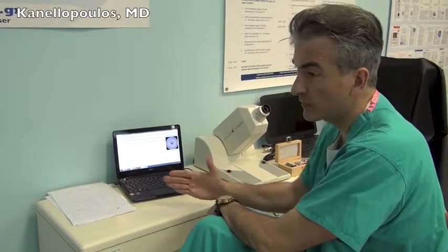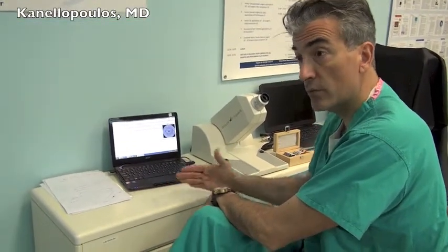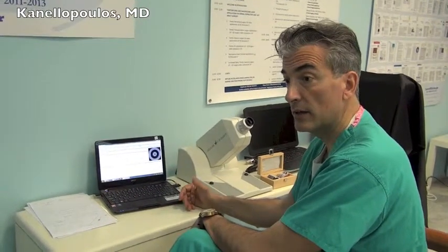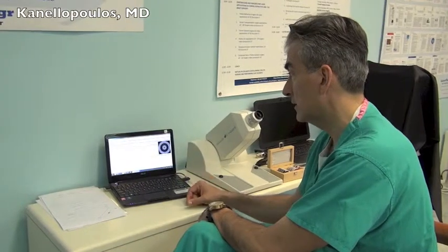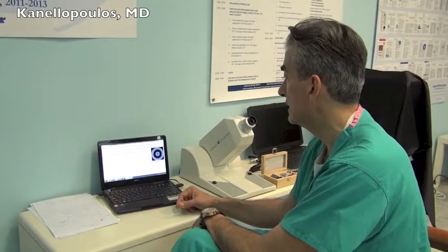In a patient complaining of poor quality of vision where topographies, wavefront, and refraction are perfect, if scatter is not good, then we have an area to look at. Perhaps an increased scatter is being created in the cornea from our laser intervention, for example.